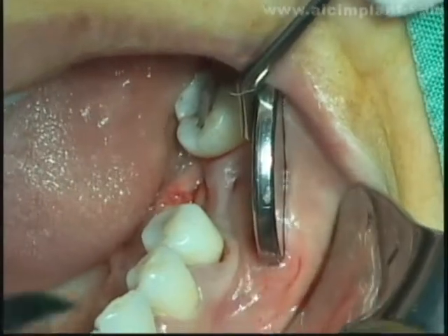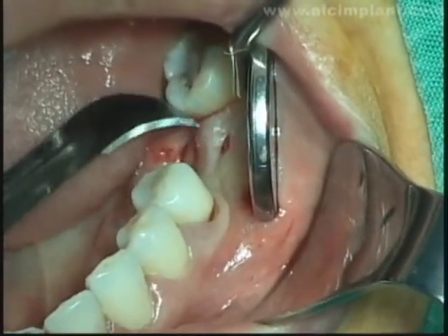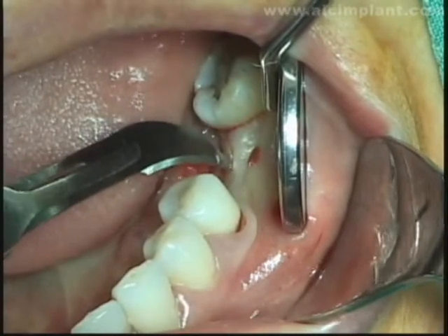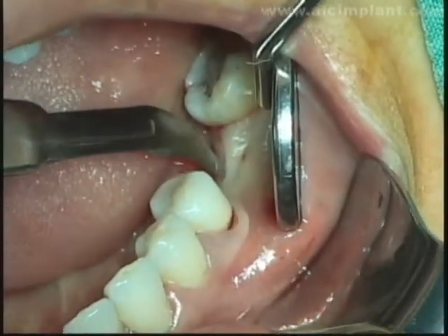The crestal incision on this region is very important. The incision will be made slightly toward the lingual side to secure at least 2 millimeters of attached gingiva on the buccal side from the mucogingival junction.